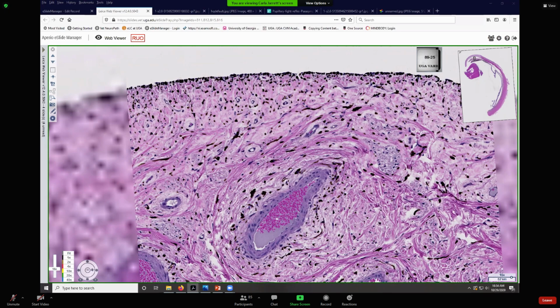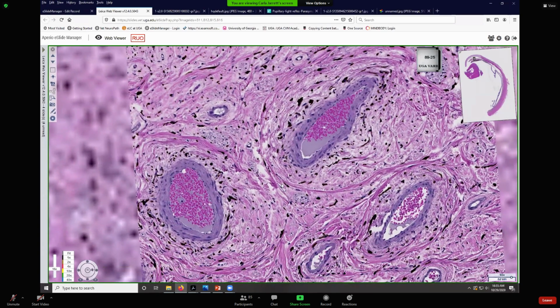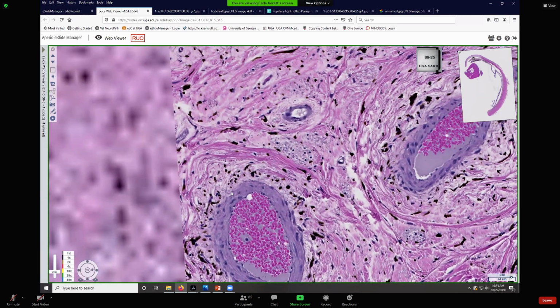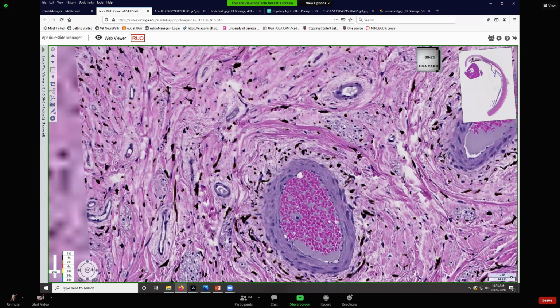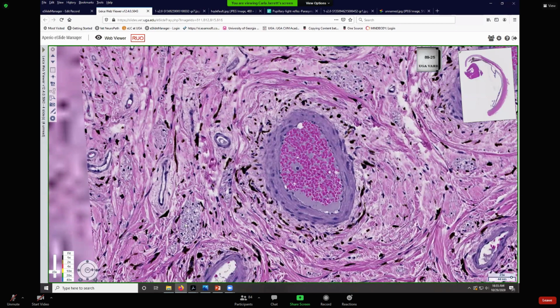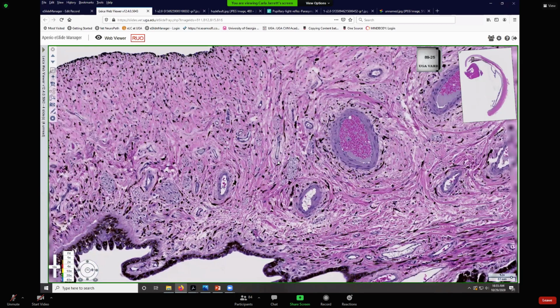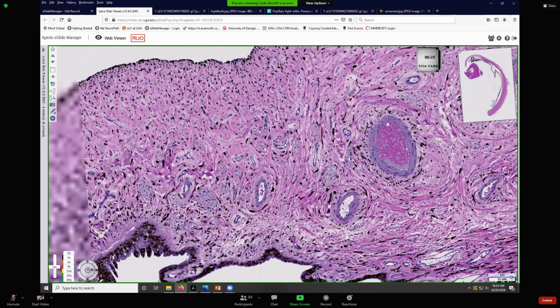Let's see, anterior limiting layer, stroma. There's a lot of smooth muscle fibers throughout the stroma, which is mostly just a dense irregular connective tissue. There are large blood vessels because we're in the uvea. There are gangbusters of nerve fascicles, and they're unmyelinated. So here we have nerve fascicles. This is an exquisitely sensitive tissue because of all the heavy innervation. And that is why anterior uveitis is so gosh darn painful.